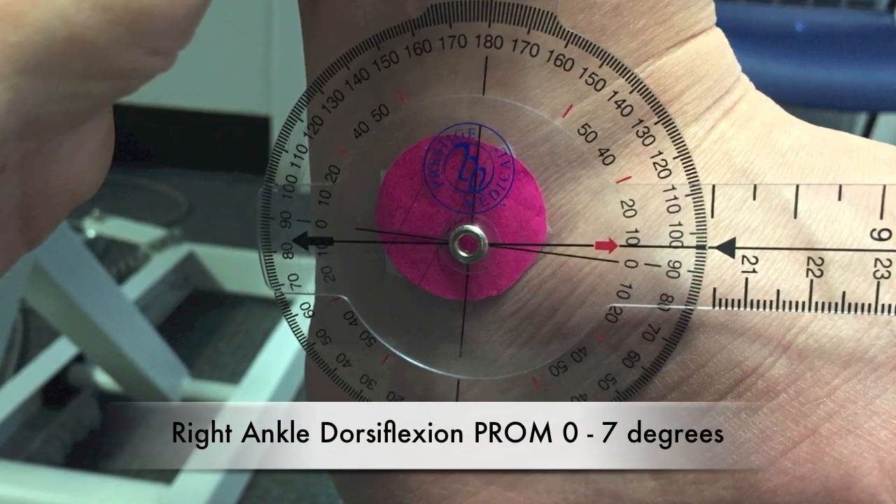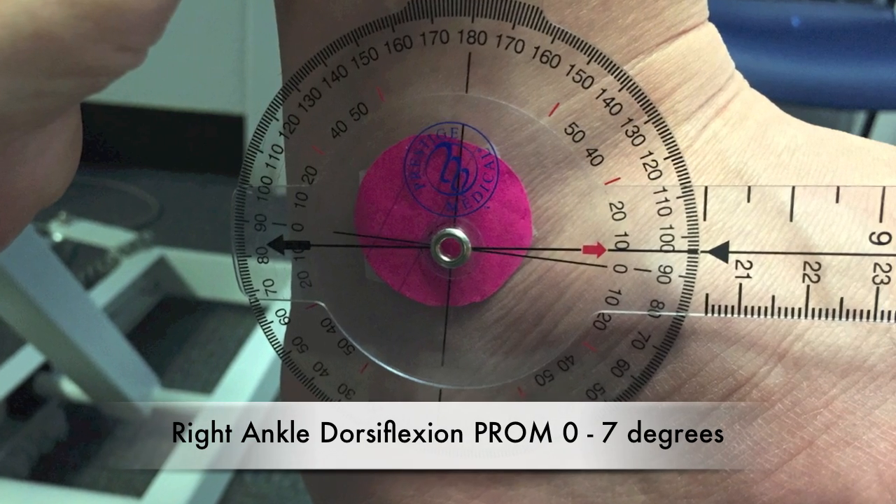Right ankle dorsiflexion passive range of motion: 0 to 7 degrees.